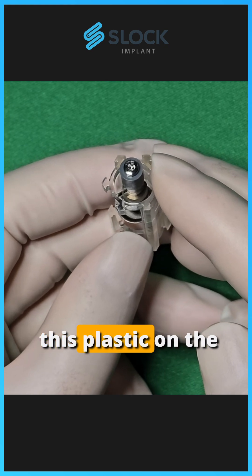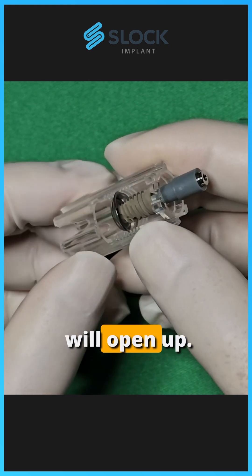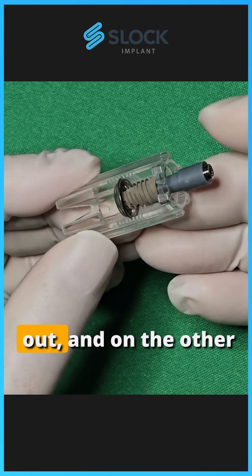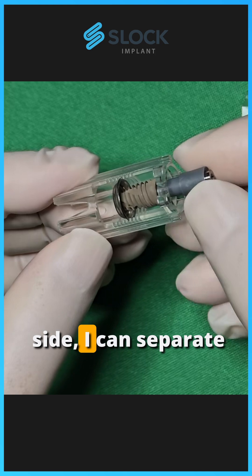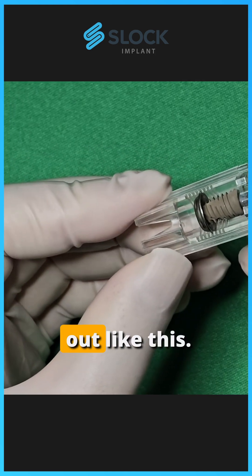Now if I squeeze this plastic on the bottom of the fixture capsule, on the bottom of the fixture, it will open up. I can hold the healing plug on one side to keep the implant fixture from falling out, and on the other side, I can separate this fixture capsule like this, and then pull the fixture out like this.